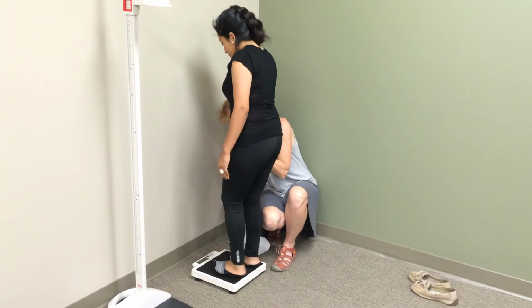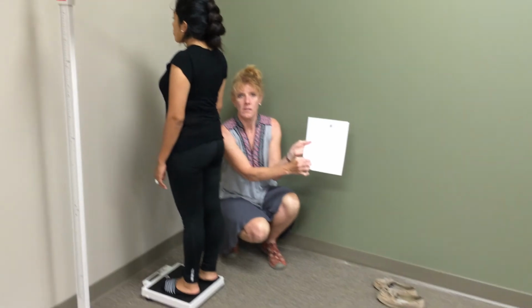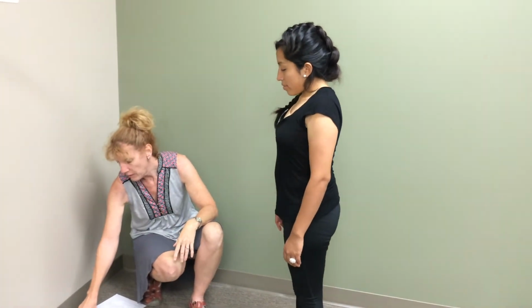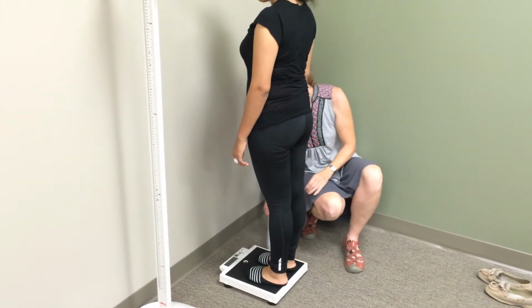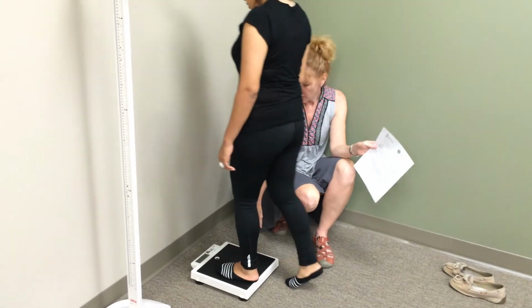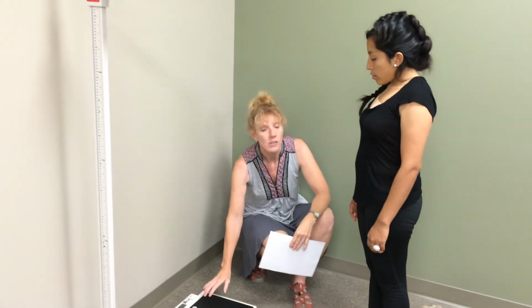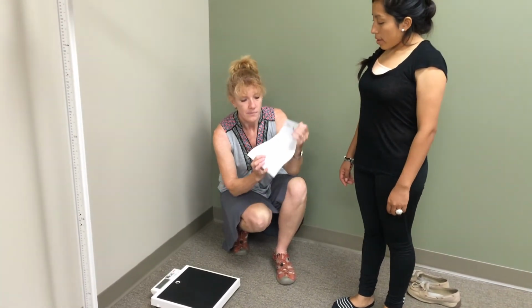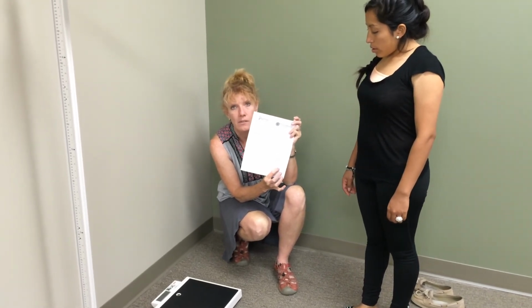Okay, step up on the scale. I write down how many kilograms. Say, okay, step off. We wait for it to get back to 0, and then we have the child step back on again. And we write the number here. What I found with these scales is that the two numbers are almost always identical. I haven't had any issues with the scale not measuring the same way between the two measurements. And then on the third and the average, you just average those two numbers and you fill it in here.